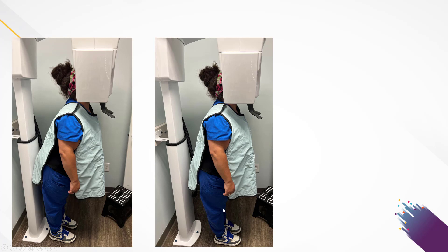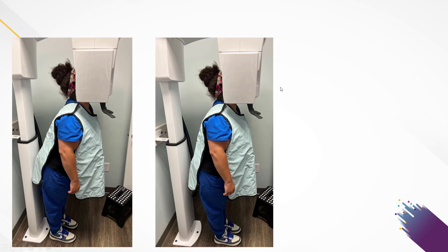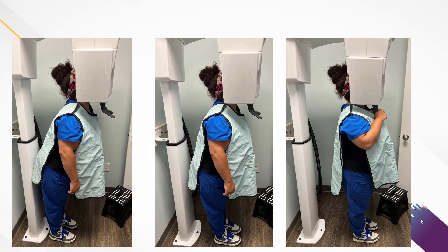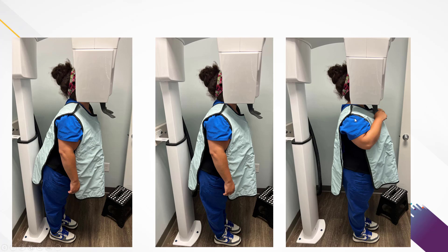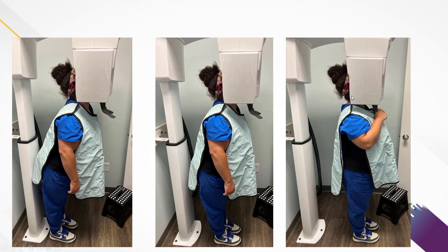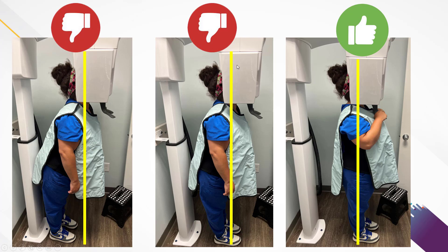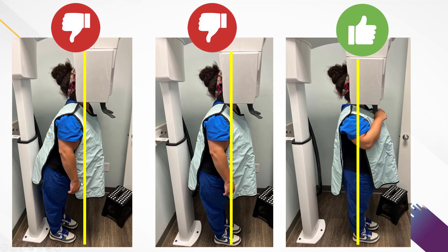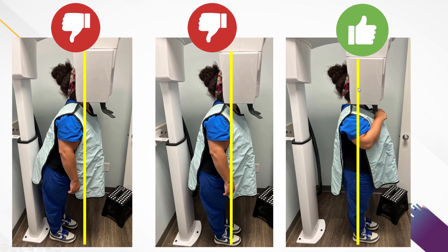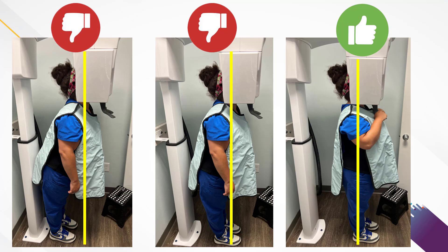This next one is a little bit better — you can see the patient is still leaning in a little bit further than they really want to be, and again, harder to detect if only looking from the front. This is going to be a much better body position: their feet are all the way forward, they're standing up nice and straight. This is much more effective for getting a good image and ensuring nice clearance for the machine — not hitting the head, not hitting the shoulders. You can see this reference line lined up in the same area each time, and in the ideal position it's lined up right at the patient's heels, going up through her legs, body, and head in a nice straight line.